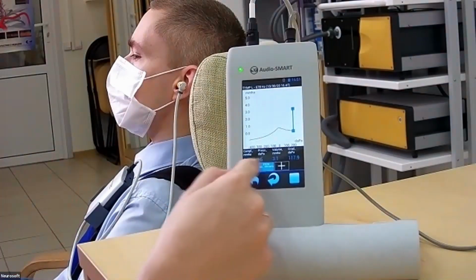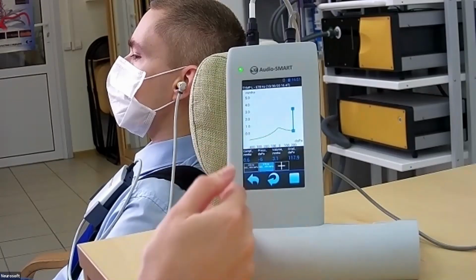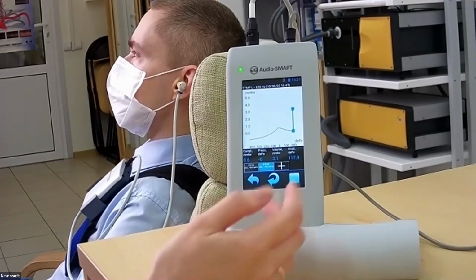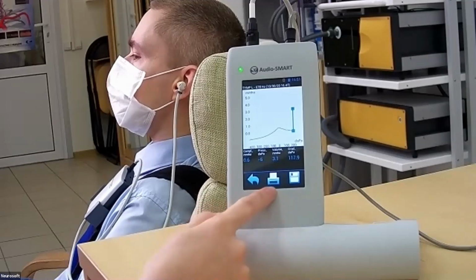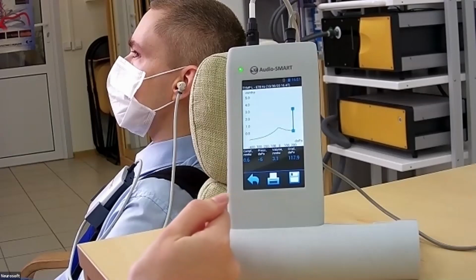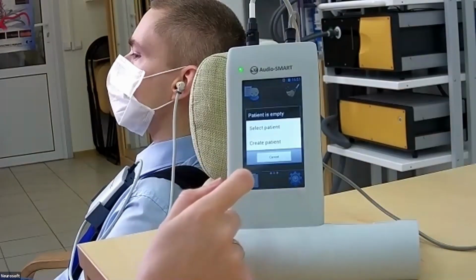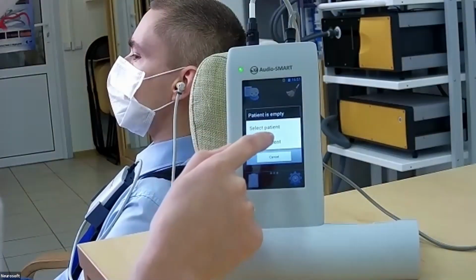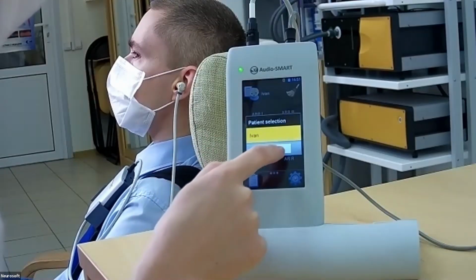And so you can plus other types of tympanogram here. After you finished, you save the results and can print via Bluetooth printer if you have. After that, yes, we save. Then you patient, we did, so we can select, for example, the last one.